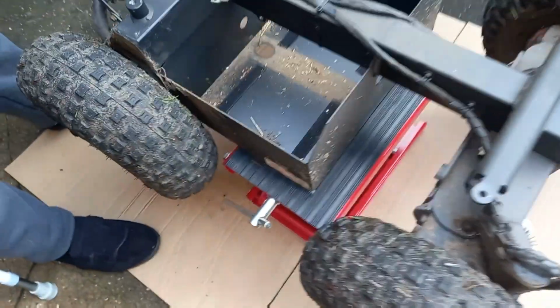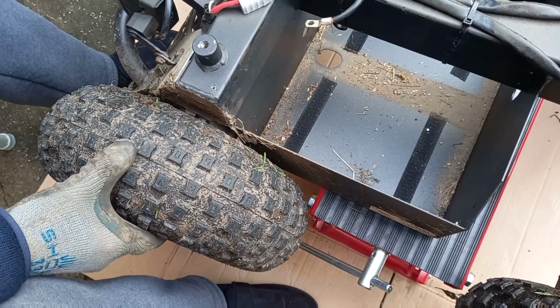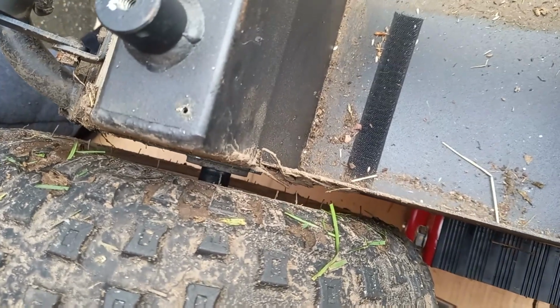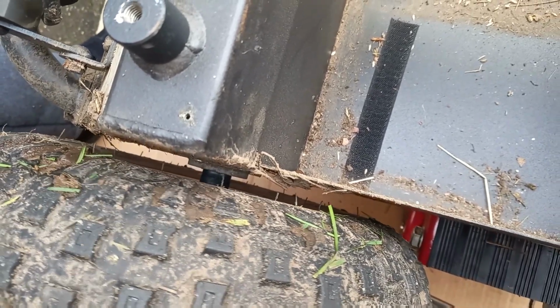Well, it isn't a problem at all, but we have found that the back wheels are actually loose on the drive motor shafts, which means that the bolt down the middle has worked loose. Probably there's no thread lock and no locking washers or anything, you see. Now that can't be left like that. If you look down there, the motor shaft's not moving at all. It's the actual hub that's moving on the actual motor shaft.